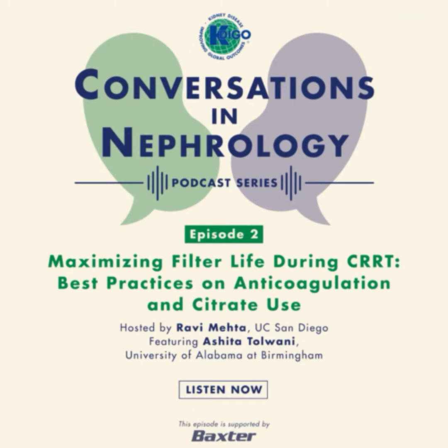So, Ashita, to start, why is the circuit patency and integrity important for CRRT, and what are the key issues that we should consider? CRRT stands for Continuous Renal Replacement Therapy. So to provide effective solute clearance and fluid removal, it really needs to run uninterrupted. And we know that decreased circuit patency results in significant time off the CRRT device.